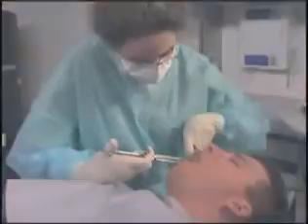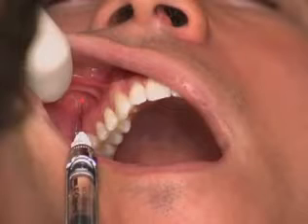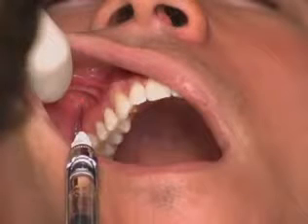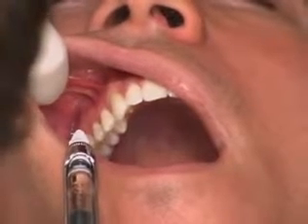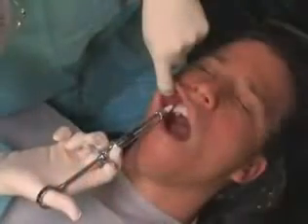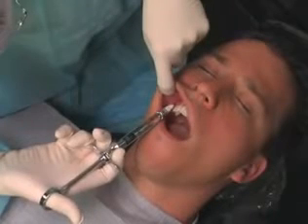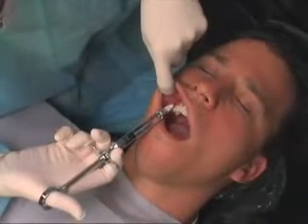The insertion site is at the height of the buccal fold adjacent to the maxillary second premolar. The needle is inserted until its tip is located well above the apex of the second premolar. After two negative aspirations, half a cartridge of local anesthetic is slowly deposited.